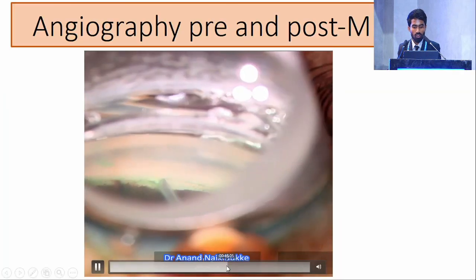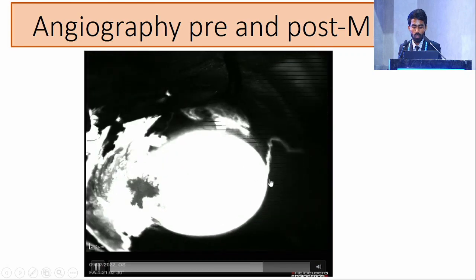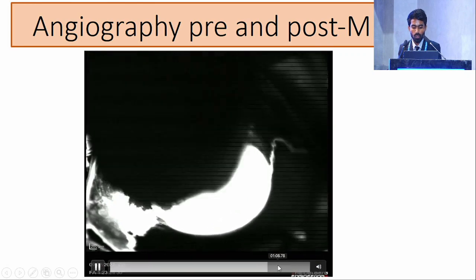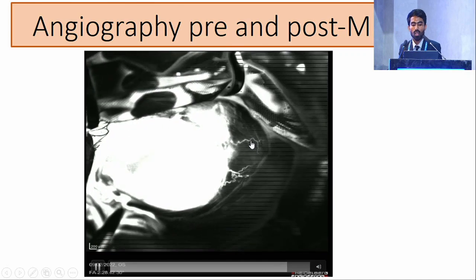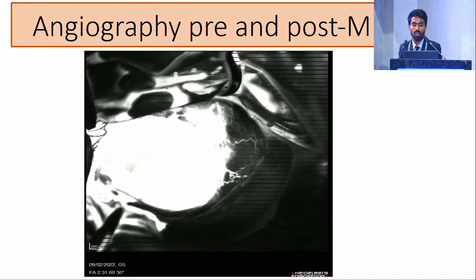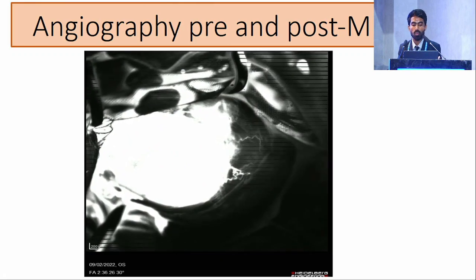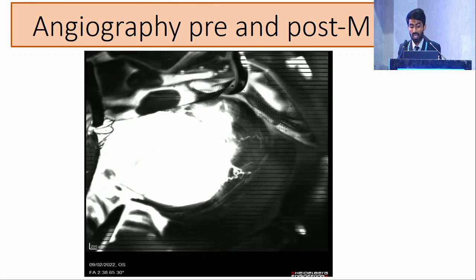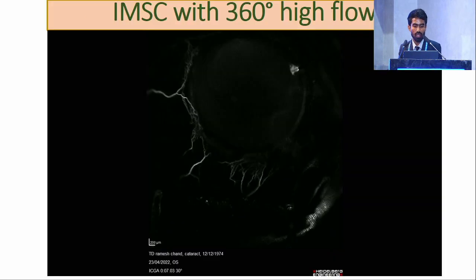Here we performed goniectomy in the temporal quadrant, and later at the goniectomy area, two new aqueous outflow channels opened up in this advanced glaucoma patient. Performing temporal versus nasal is according to the surgeon's convenience; we usually do minimally invasive glaucoma surgeries at the nasal quadrant in view of surgeon access. But doing these surgeries temporally gives greater efficacy, with greater lowering of intraocular pressure.